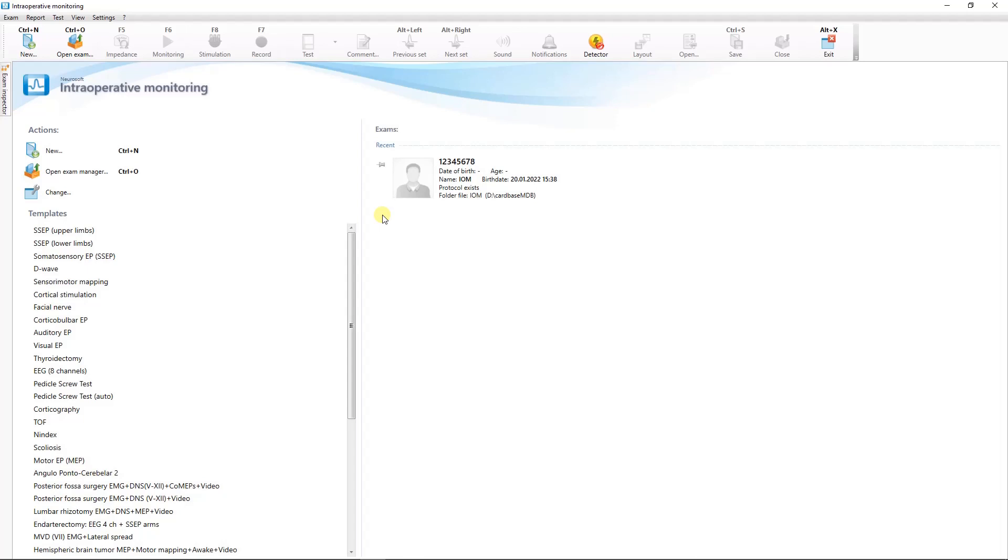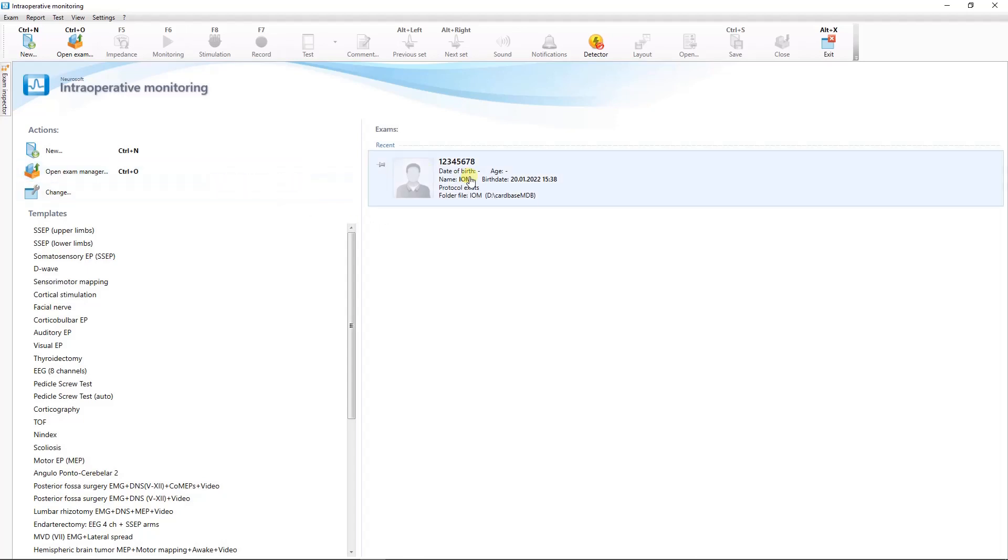To view the monitoring data, use the exam manager or click on the name of the exam in the list of the last recorded examinations. Thank you.